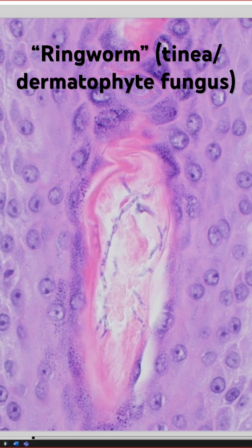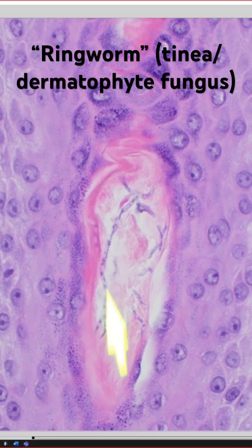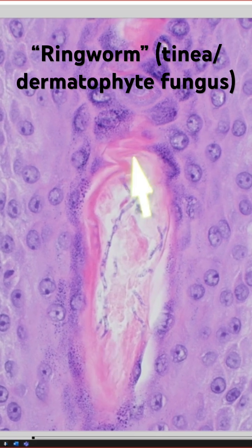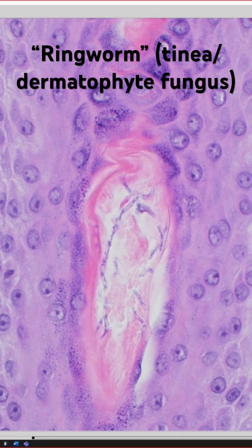You can see it right here, and it's kind of got a purplish stain. Normally, dermatophytes are clear on H&E, but Malassezia or Pityrosporum, and also Candida, are almost always bluish-purple like this.